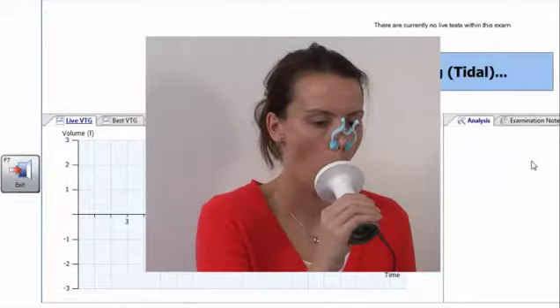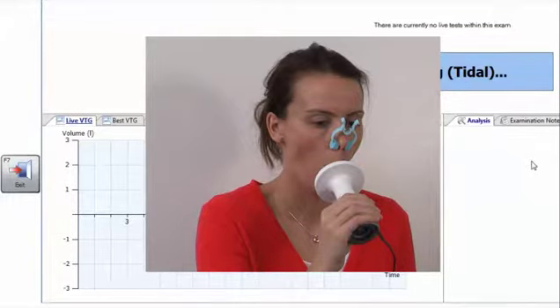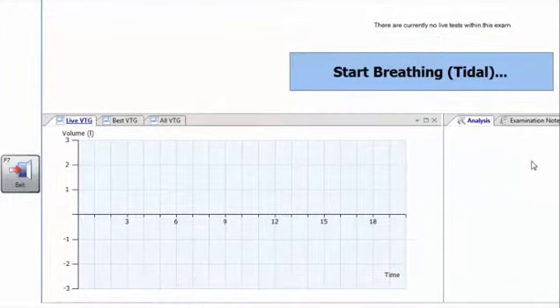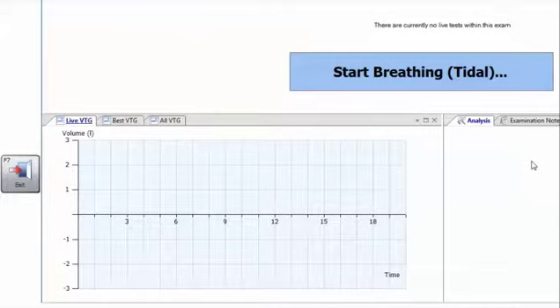The patient should now be asked to tidally breathe for at least three breaths. When three stable tidal breaths have been detected, a vertical line will appear on the graph.